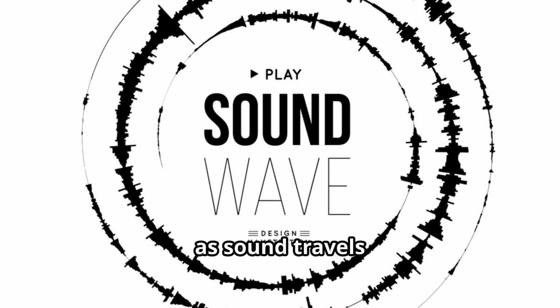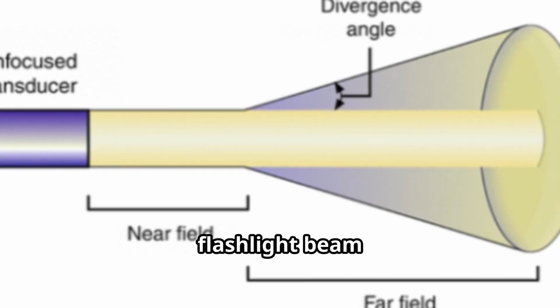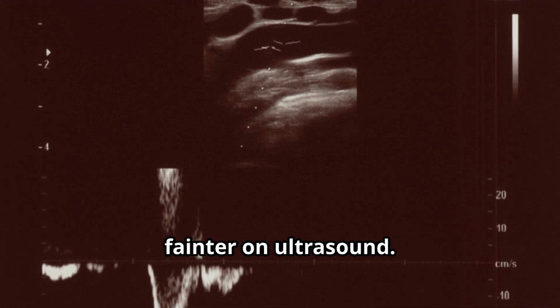Finally, as sound travels deeper, it spreads out, divergence. Imagine a flashlight beam getting dimmer as it widens. That's why deeper structures look fainter on ultrasound.